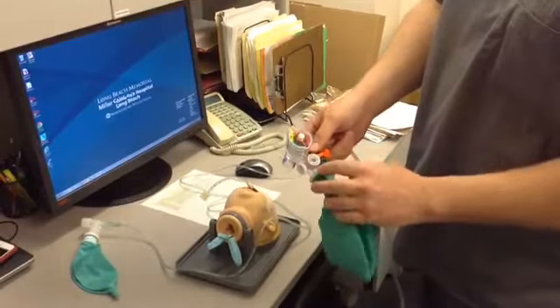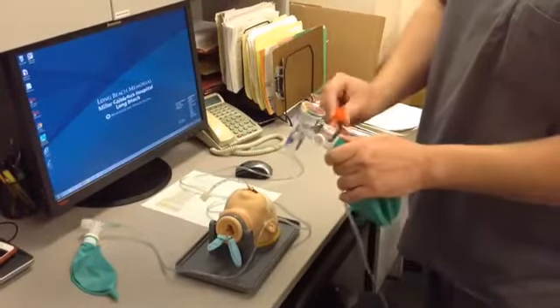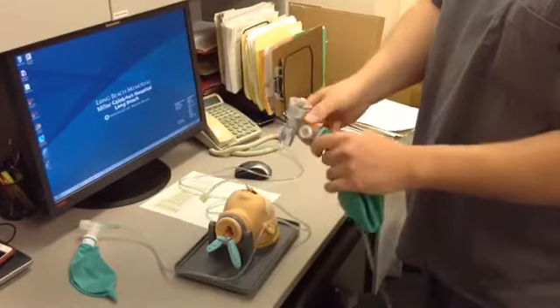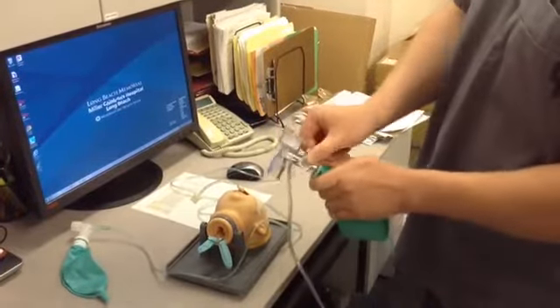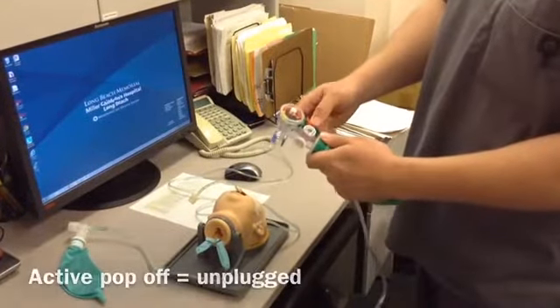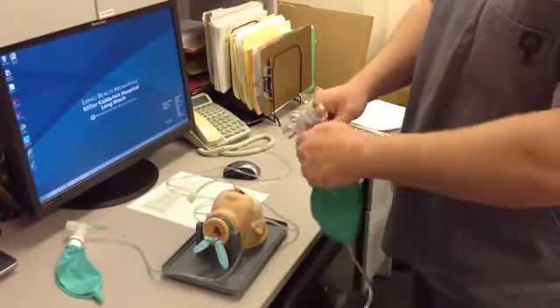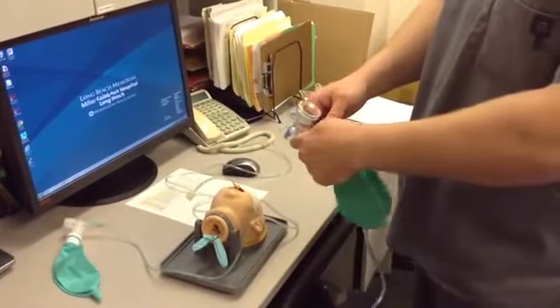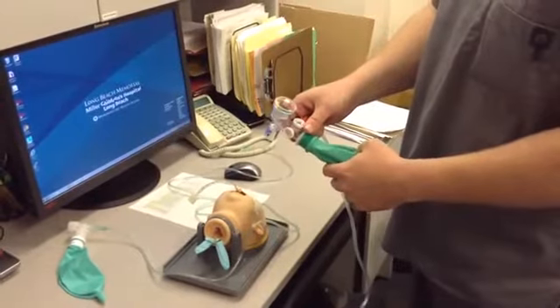The way this works, if you reach pressures over 40, it's going to come out this hole. So if you have the orange plug in place, it's going to deactivate it and air won't be able to escape out the hole. So always have this opened. The next feature is the PEEP valve. If you turn the PEEP valve away from you counterclockwise, it's going to trap more air. If you turn it towards you clockwise, it's going to allow more air to escape.